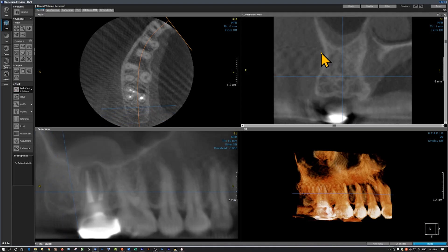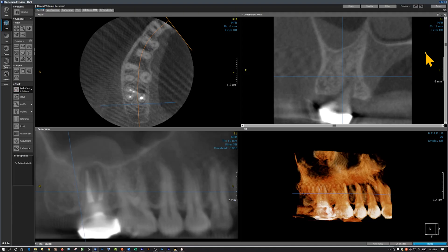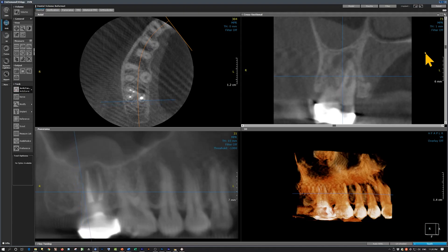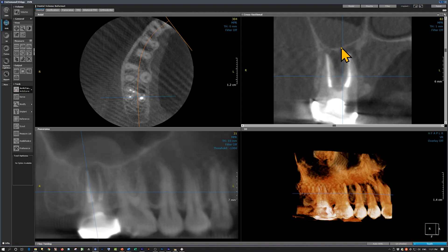On the coronal view, this is the buccal cortical plate and this is the palatal cortical plate. As we move anteriorly, we can see that the distobuccal root and the palatal root are obturated. The palatal cortical plate is disrupted here. The sinus floor is thin and probably eroded.